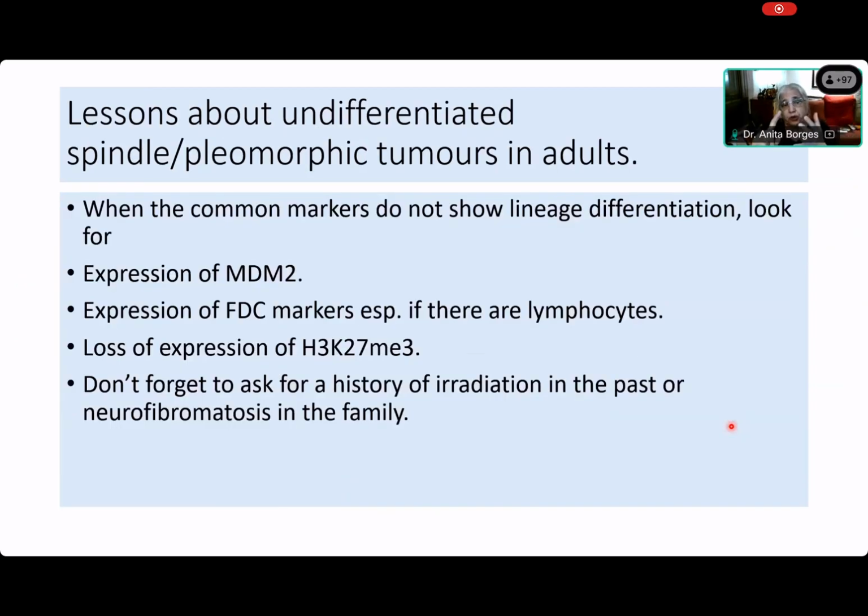You cannot miss a neurofibroma. You cannot miss a schwannoma. If you miss that, there's something terribly wrong. Okay, those two you just cannot miss. You cannot sort of miss a nodular fasciitis, or at least miss myofibroblasts. All right. The ulcer, I just put it there so that you could notice what happens in a lesion that is repairing, or acute inflammation that is undergoing reparation.